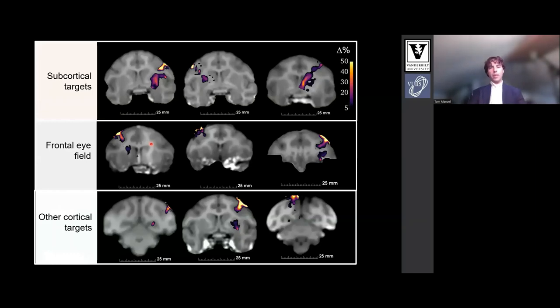We performed our opening in 12 therapies at subcortical, cortical, and frontal eye field targets. This data shows three openings from each group where yellow indicates a 50 percent increase in contrast. From these visualizations you can appreciate variance in opening volumes achieved. The shape of opening is often elliptical in nature but also matches the contour of the underlying tissue structure, following gray matter topography. The volume in subcortical targets is larger than at the cortical targets.